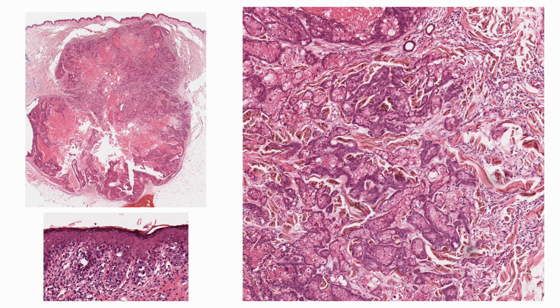And here are some more pictures showing the sebaceous differentiation, the blue cells, sebaceous cells, and also you can see the pagetoid distribution of the sebaceous carcinoma inside of the epidermis.